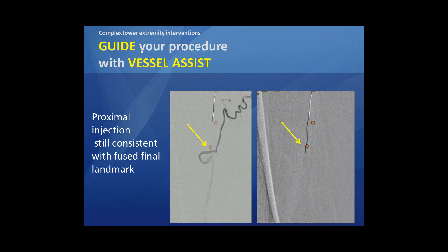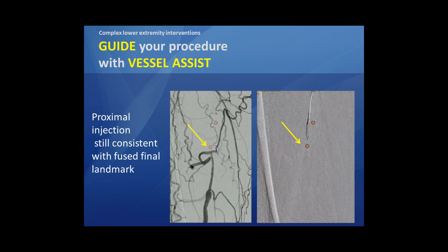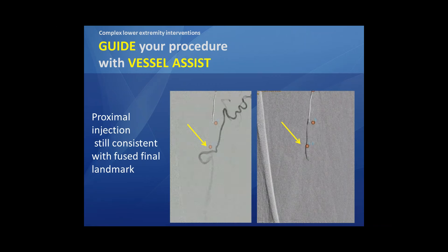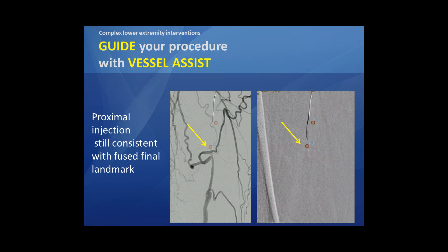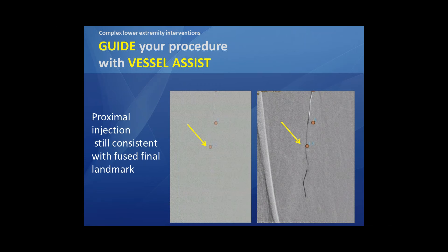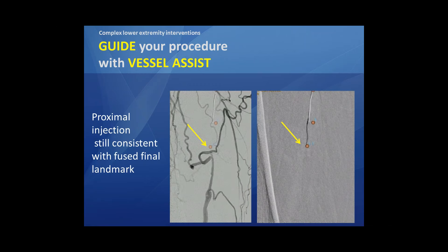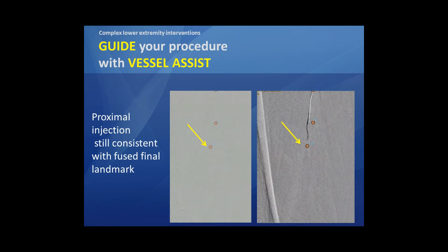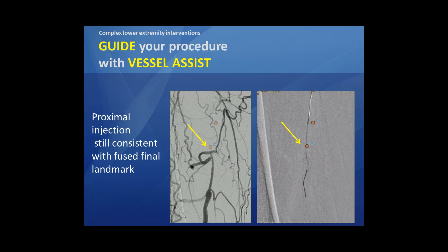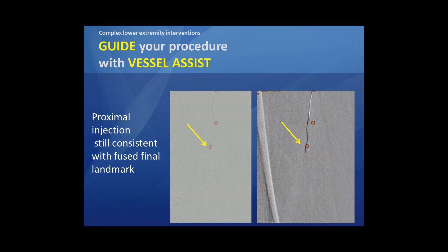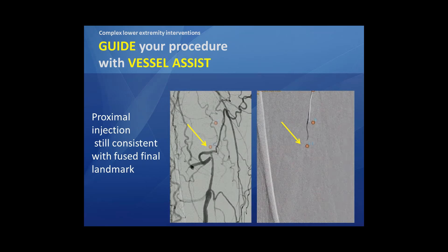Again, here you see how correct and precise the centerline tracking is. The final dot is just right at the point of reentry. This is also a way to reduce contrast injections — just to be sure when we are arriving at the entry point I don't need to inject contrast again and again through my sheath that is in place.